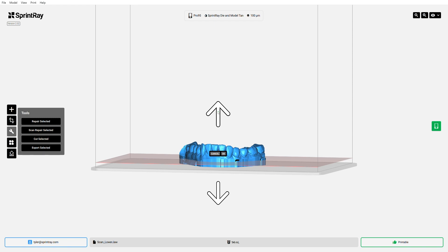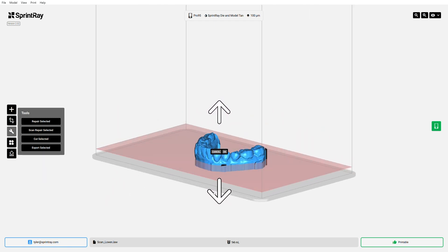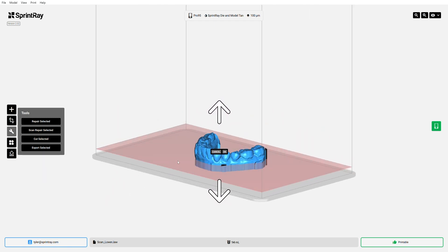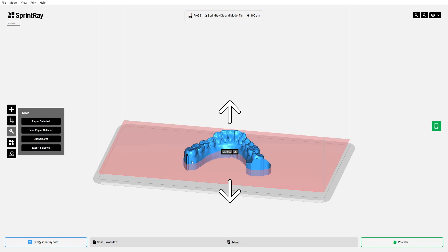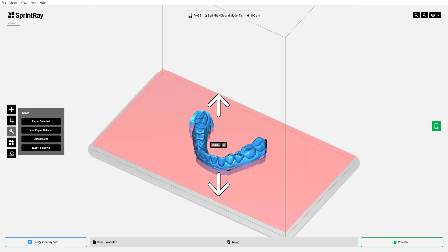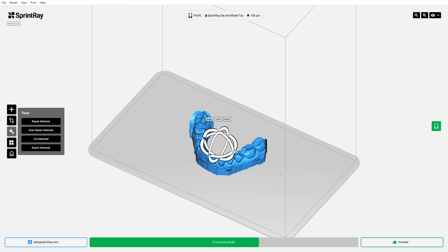So I'm looking around here at my model, I'm thinking that I can afford to lose about this much of the base. Now this is useful if you want it to print more quickly. It's useful if you want it to use less resin when it prints, or if you want to reduce the file size for when you finally export it, which we're going to do today. It's just a nice feature to have.